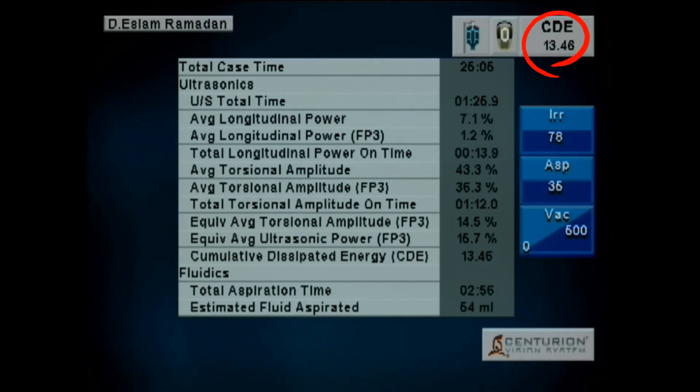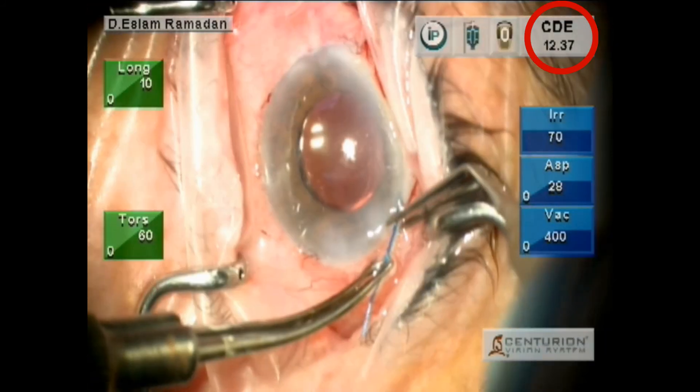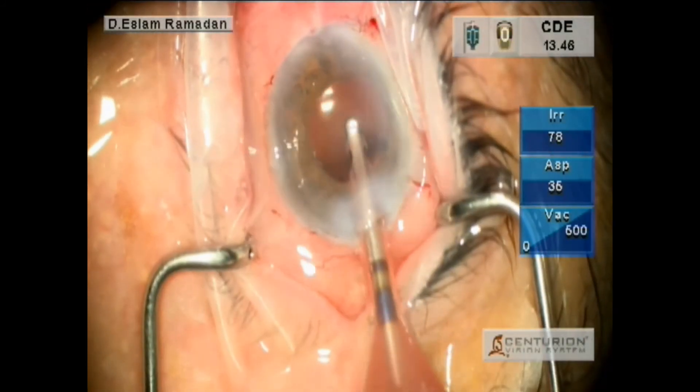Now you can see, comparing the two machines, the Centurion is more effective, with a difference of 6 in CDE. So the Centurion machine is much better than the Infinity machine. Thanks.